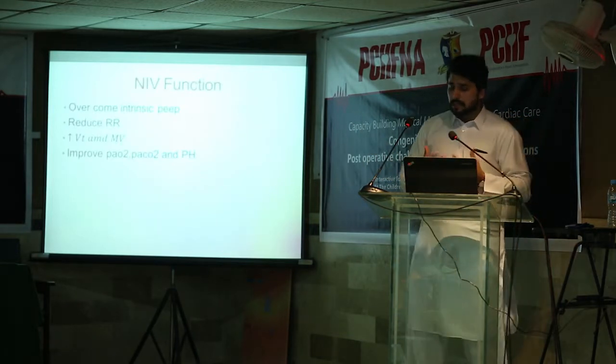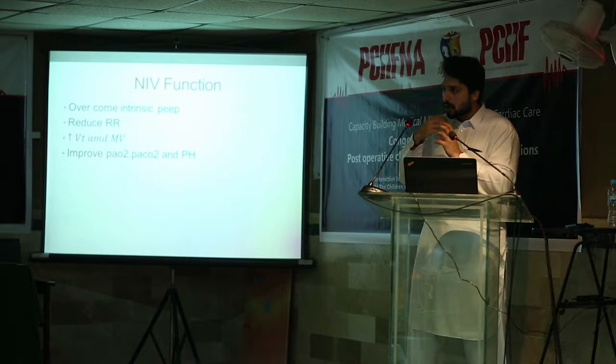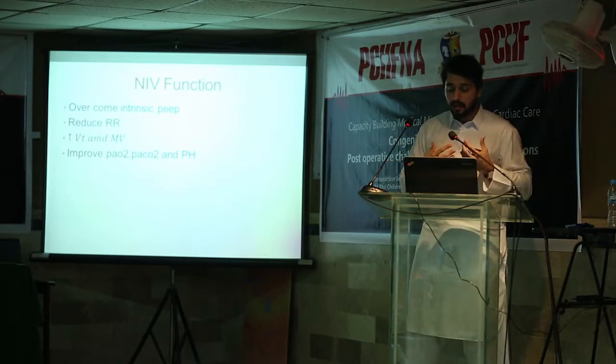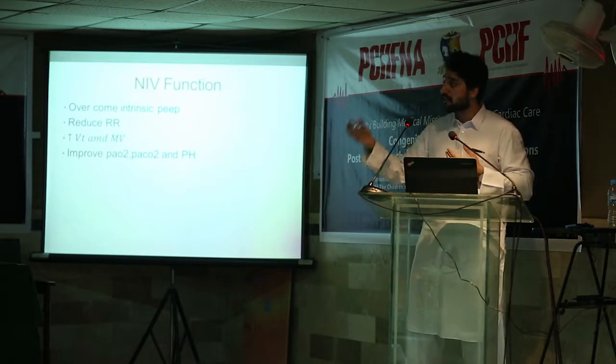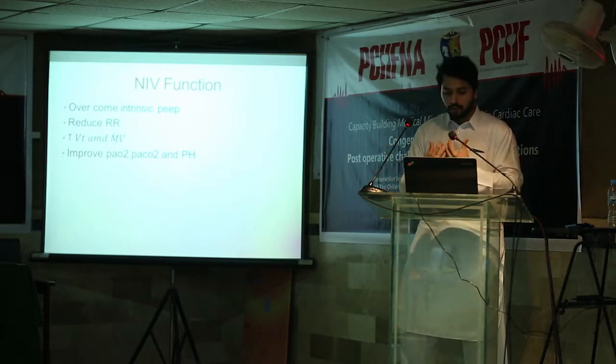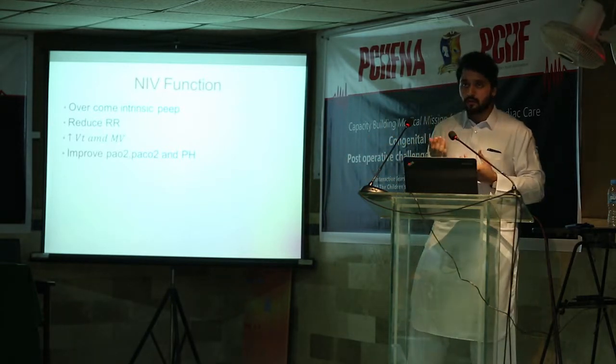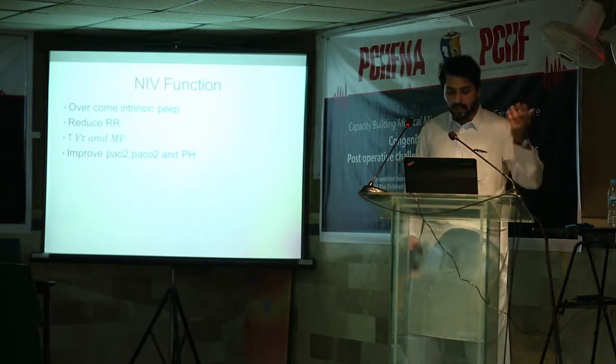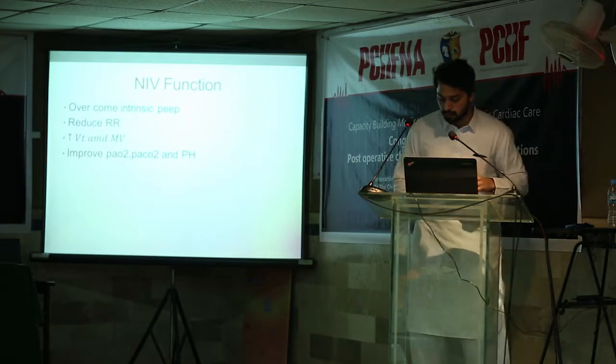So what is NIV function? What am I expecting from the NIV? Overcome the intrinsic PEEP, reduce the patient respiratory rate and work of breathing, increase his tidal volume so he can wash out more CO2, basically improve the labs: PaO2, pH, and PaCO2.